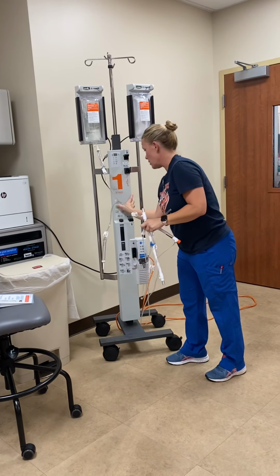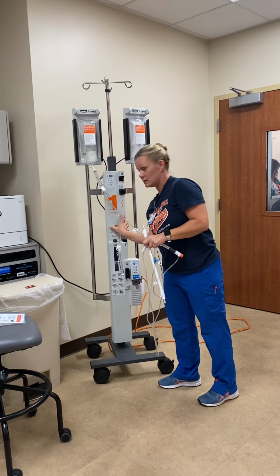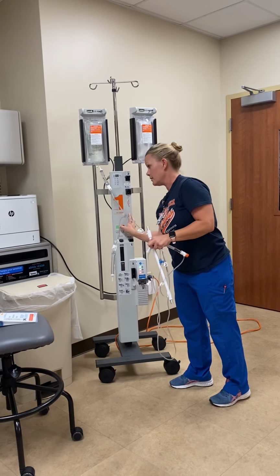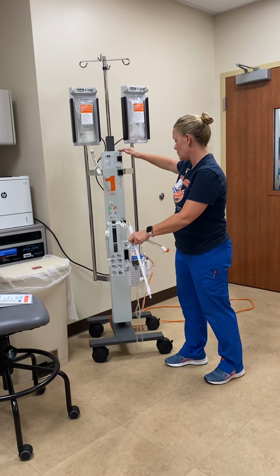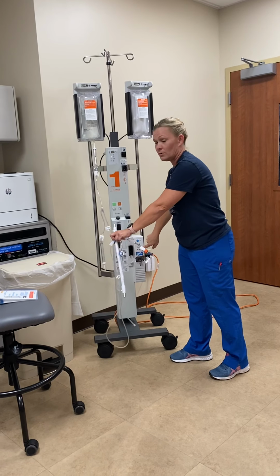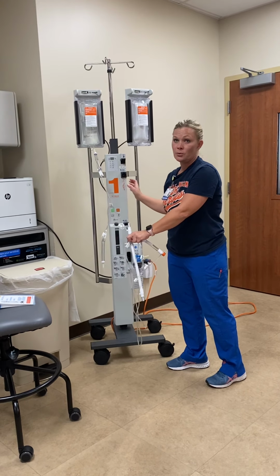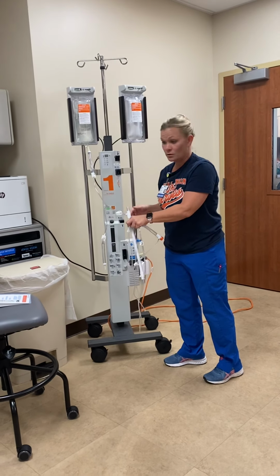You can go ahead and turn it on at this point. All you're gonna hear are a lot of beeps because you have nothing hooked up, okay? You're gonna have alarms up here because this chamber isn't set up correctly, and alarms down here because this chamber isn't set up correctly. Just for video purposes, I'm gonna get everything set up and then we'll turn it on and see what alarms still are going off, okay?